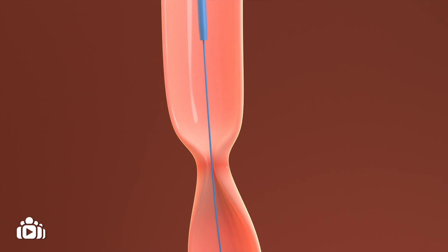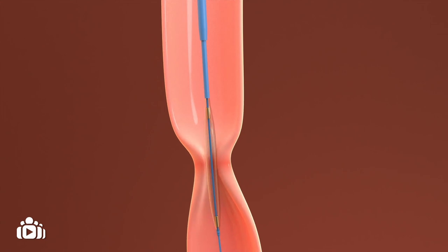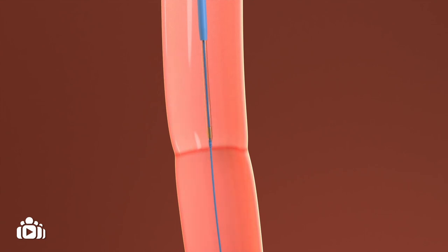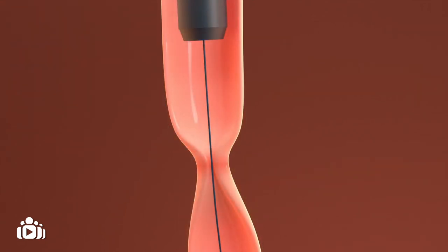In most cases, an endoscope is used to insert a small balloon inside the stricture. An endoscope is a long, flexible tube with a camera that is passed through the mouth into the esophagus. The balloon inflates to stretch open the stricture and then the balloon is removed.